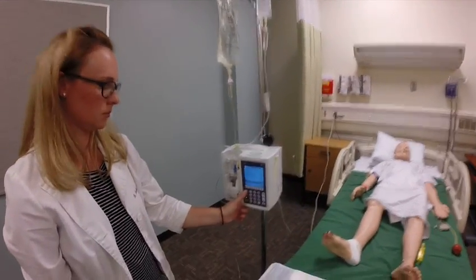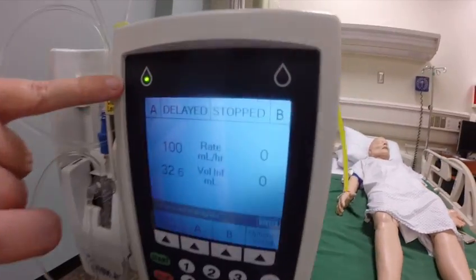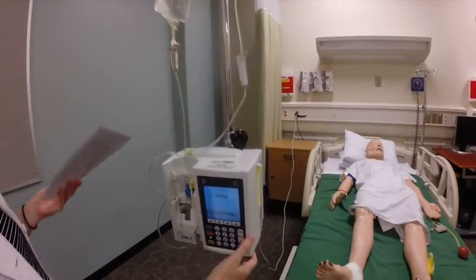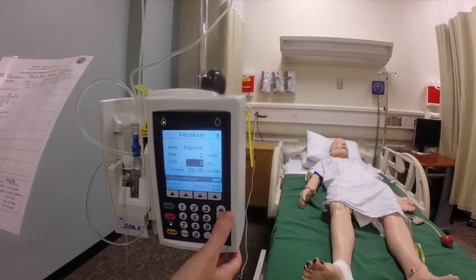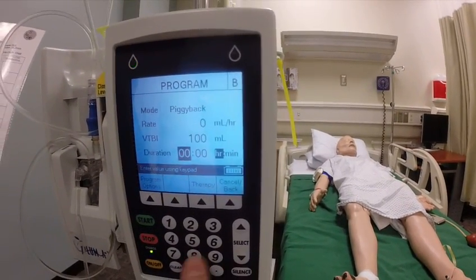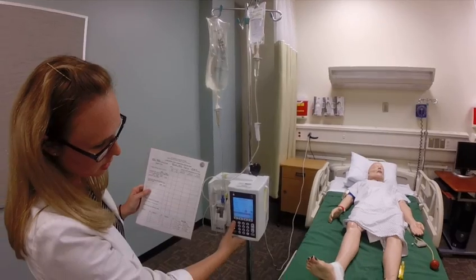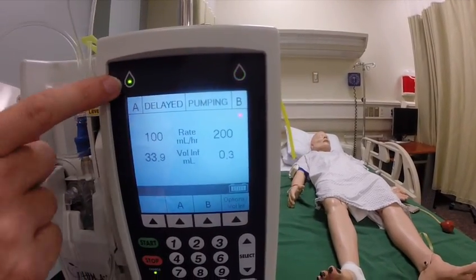Now I have to start A. So A needs to be delayed — it does not need to be stopped. Now I'm going to go to B and verify with my MAR that this is all correct information, and program my pump. If you're someone that can do this math in your head, you can program your mils per hour, which would be 200, and put your volume of 100. If you're not someone that does math in their head, go down to your volume — your order gives you 100 — and scroll down to your time of 30 minutes, and it programs your rate for you. Now before I hit start on my B line, I'm doing my third check, making sure the med and my rate are correct, and then I hit start. Now my B line is pumping and my A line is delayed. After my B line is complete, my A line will pick back up.